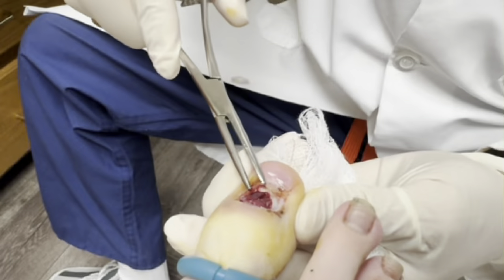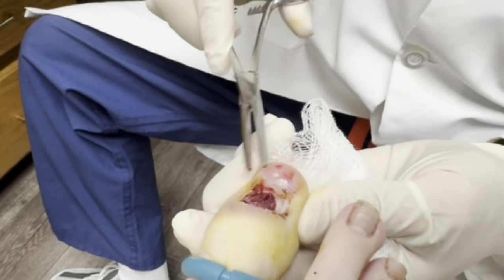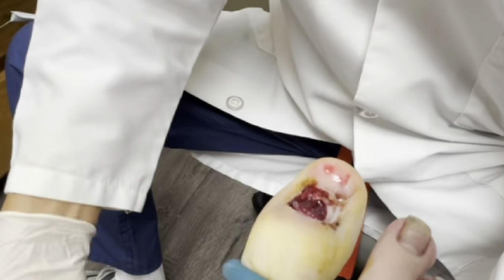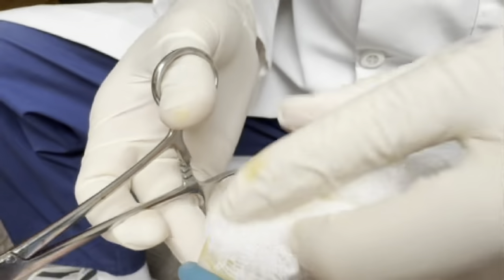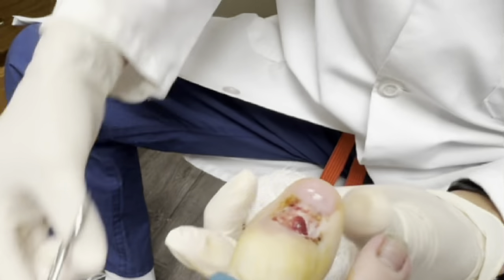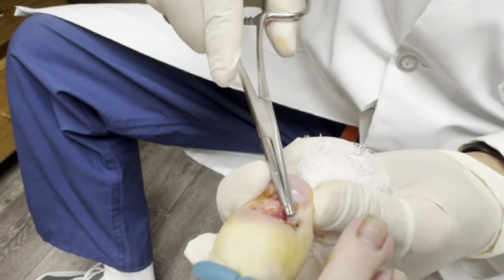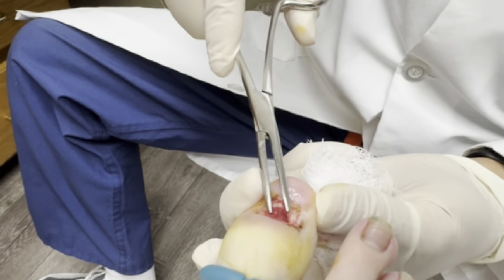And send it off to the laboratory. You start bleeding a little, so let's clean out the area a little bit. There's another tissue that we need to send off — clean it up really good.